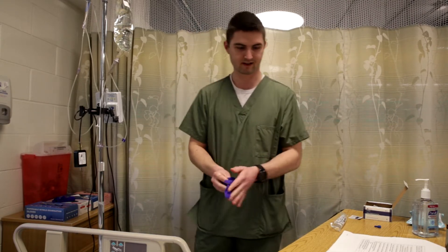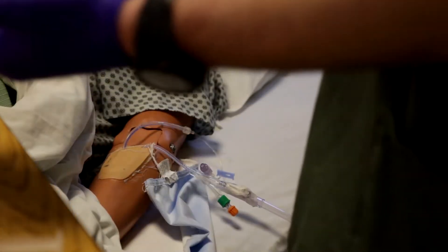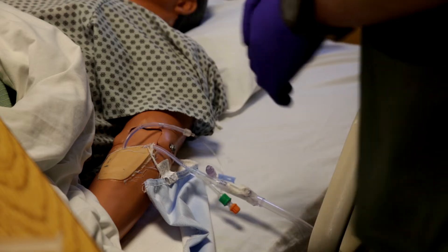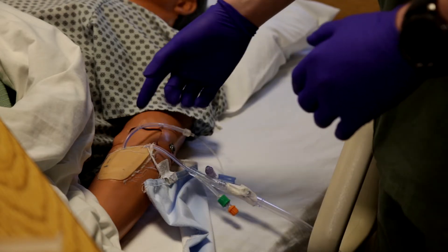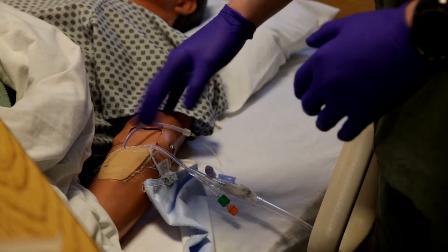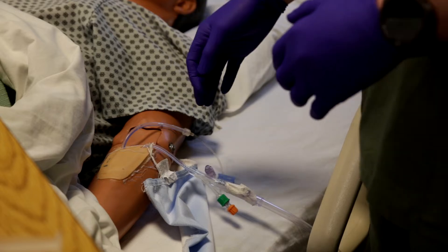Hand hygiene first before I do anything. I already did hand hygiene and I put my gloves on. I'm going to inspect the IV site looking for signs of infiltration, any signs of infection like redness, swelling, and if they're reporting any pain. Now that I have inspected and it's intact, I'm going to get my flush ready.